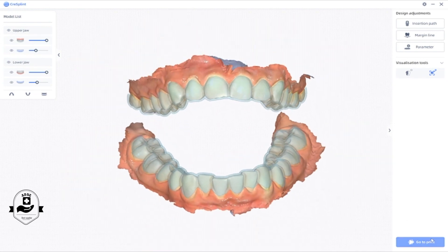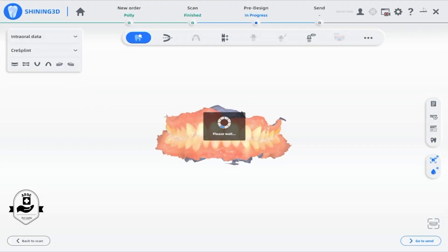The design data can be imported to the printer directly for printing. This improves the efficiency of the entire workflow.